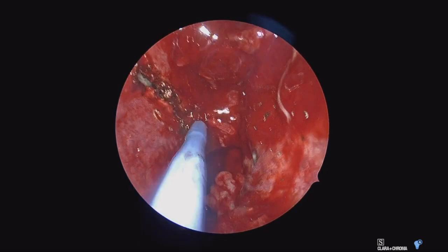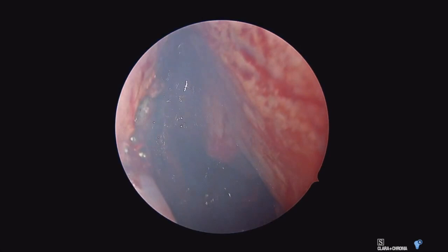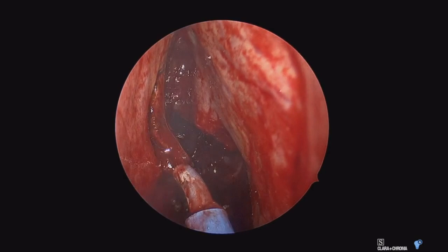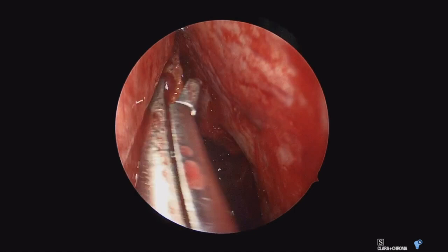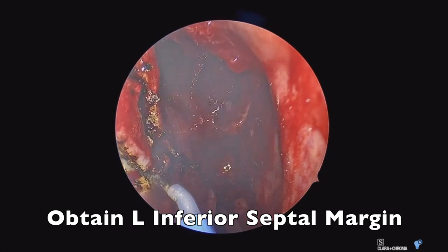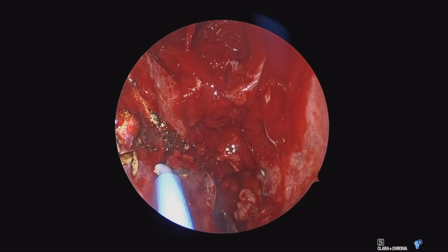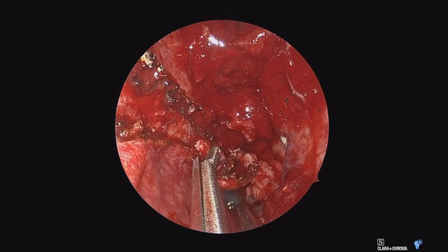Here we are making those mucosal cuts on the left side and then performing our septectomy. I typically sample the margin on the side left in the nasal cavity — resecting the area of tumor itself, then sampling the mucosa on the remaining side. Here's incising and checking our left inferior and anterior inferior septal margins. I label these carefully to ensure I know exactly where in the nasal cavity they came from, so if anything comes back positive, we can easily go back and track that.